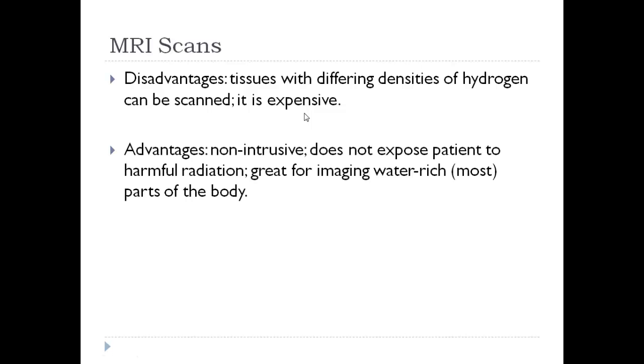There are many advantages. It's great for imaging. It's non-intrusive and it doesn't expose the patient to any harmful radiation, as we're just using radiophotons. But above all, it produces really, really clear images that are very useful for diagnosing a large number of issues with the human body.